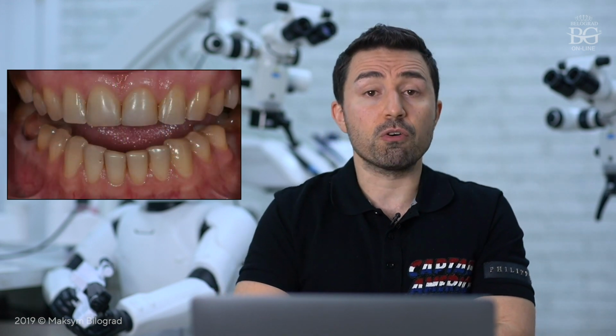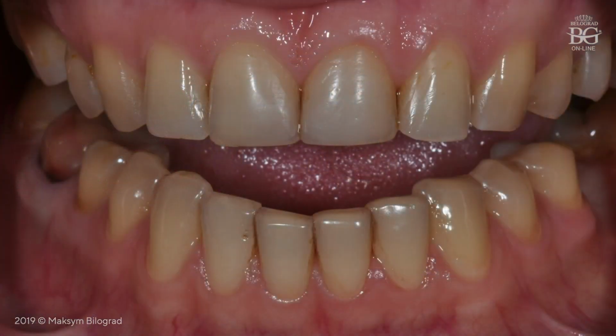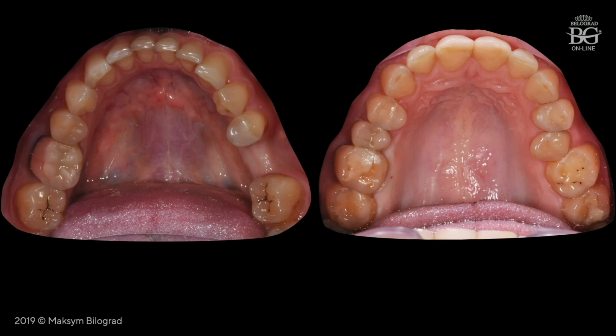Let's go back to intraoral pictures because we would also like to show you some interesting aspects of her lower teeth. You can see that the lower teeth are abraded, and from the cervical areas you can see patterns of overload. So again, we have to do occlusal rehabilitation in this case, because otherwise we may fail the case.